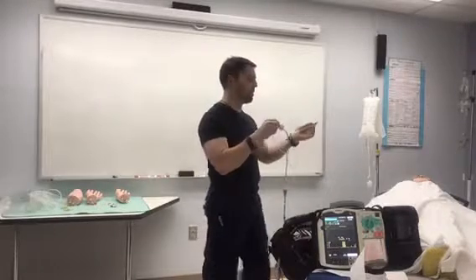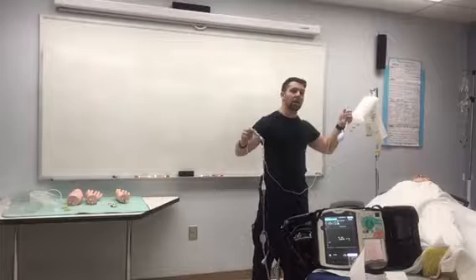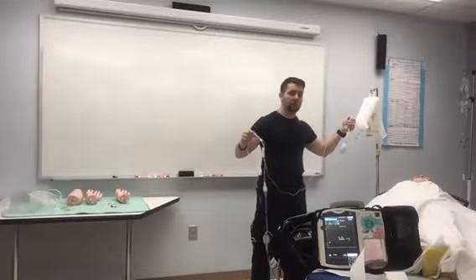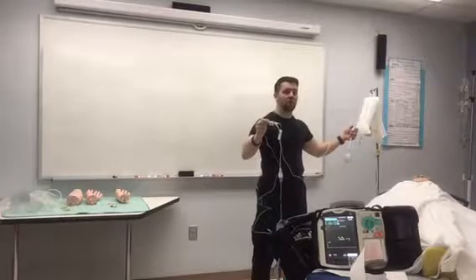Well, one of the things that can cause too much absorption of being able to see the pressure variance is if this side is under pressure. So then we come over here and we look and we're like, oh, we lost pressure here. So therefore we have an over-dampened line, too much dampening on the line.